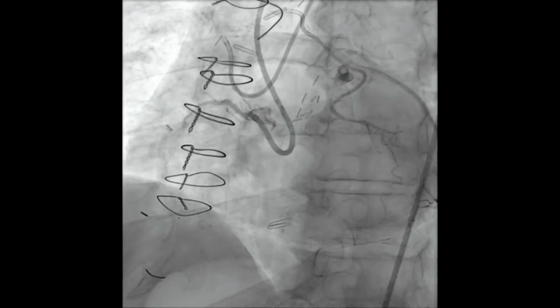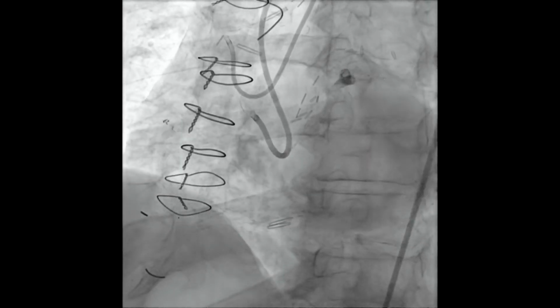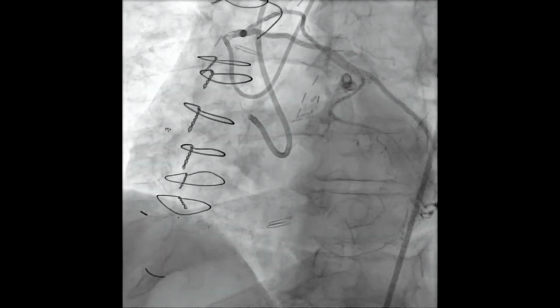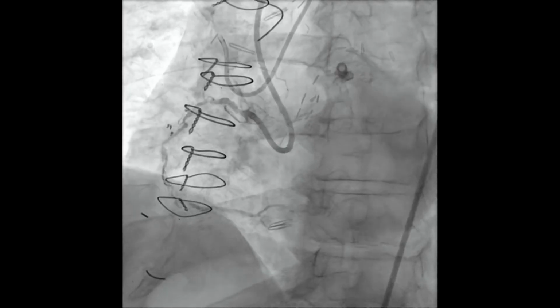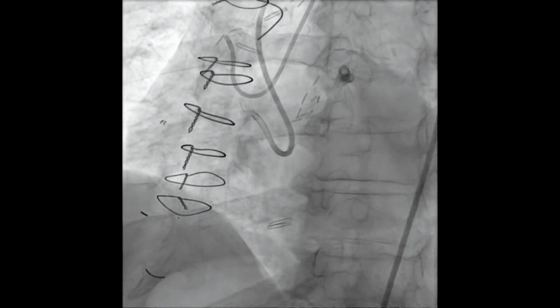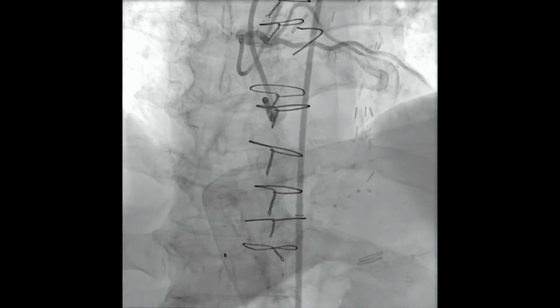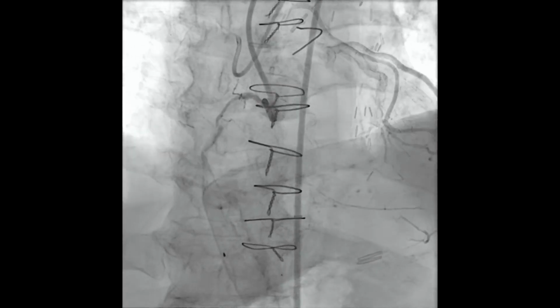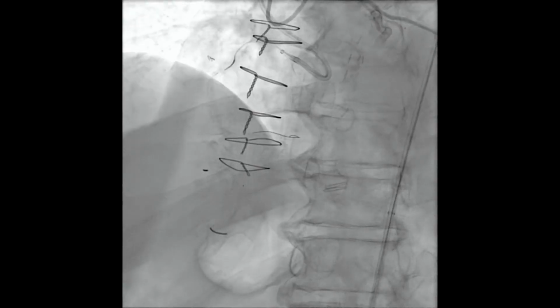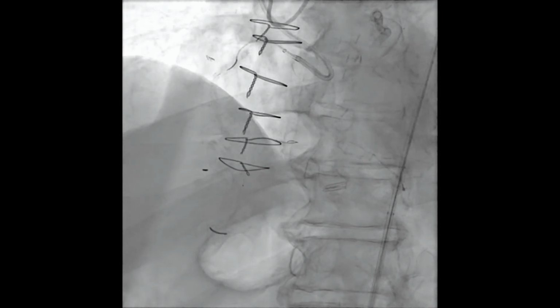So looking at a patient who had a couple of these modalities used: a 78-year-old gentleman with a history of bypass. His left radial had been used for bypass, which is why we're going in that way. I apologize to those of you who are biradialists to see that there. He had demonstrable ischemia and viability on his MRI, on 4 antianginals, and was still having chest pain. So he came in for RCA CTO PCI, and had a history of stenting of that proximal right as well. We thought initially that there was going to be a microchannel that would connect all the way to the distal vessel. But as Elias showed in a previous case, sometimes the best microchannels are bridging collaterals or non-existent at all.